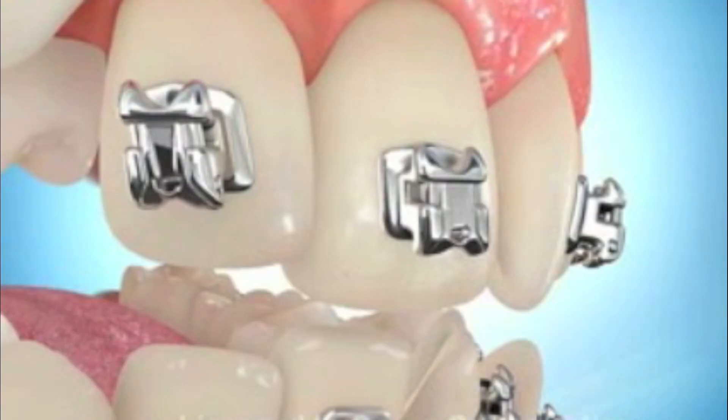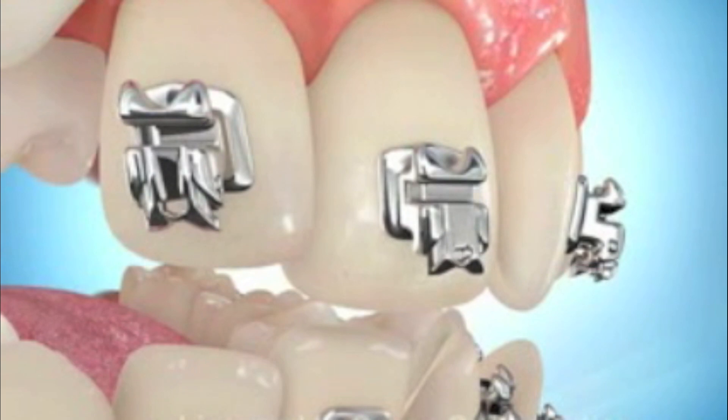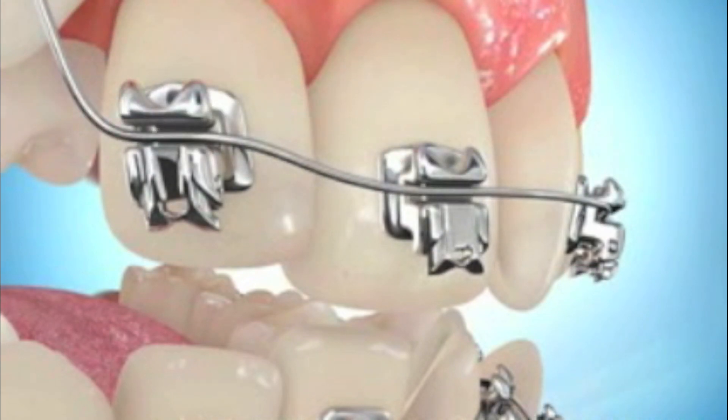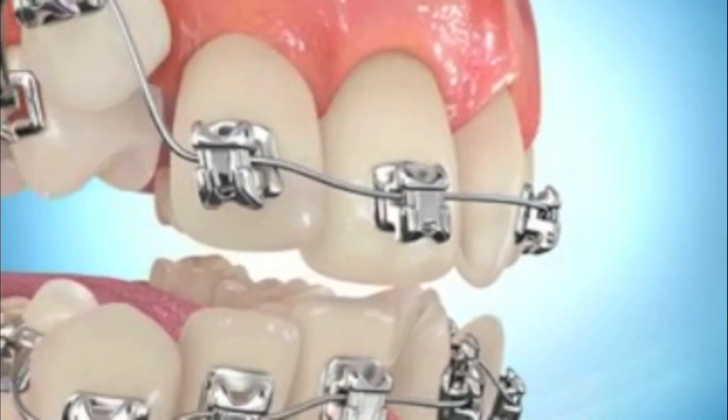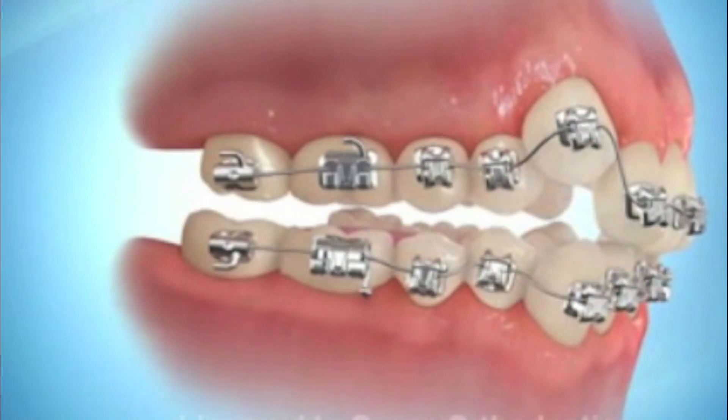In the beginning, the process is for those very thin wires to just put gentle forces on and line up the bracket slots. The slot is like a groove in the bracket that the wire lies in. And so if the brackets have been well positioned, once the wire becomes flat, the teeth are pretty close to in line.